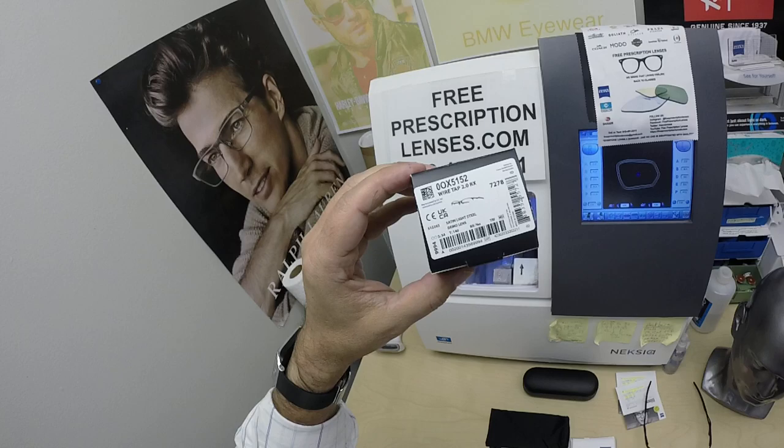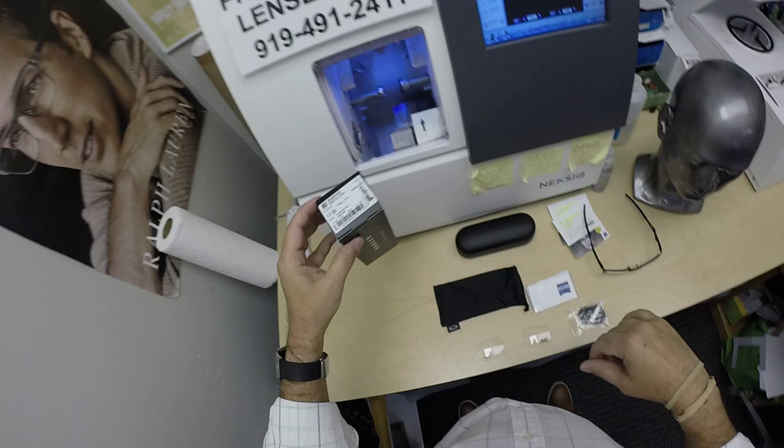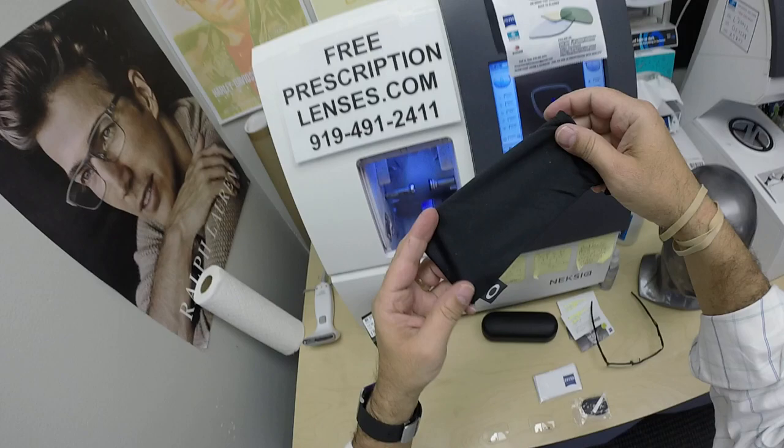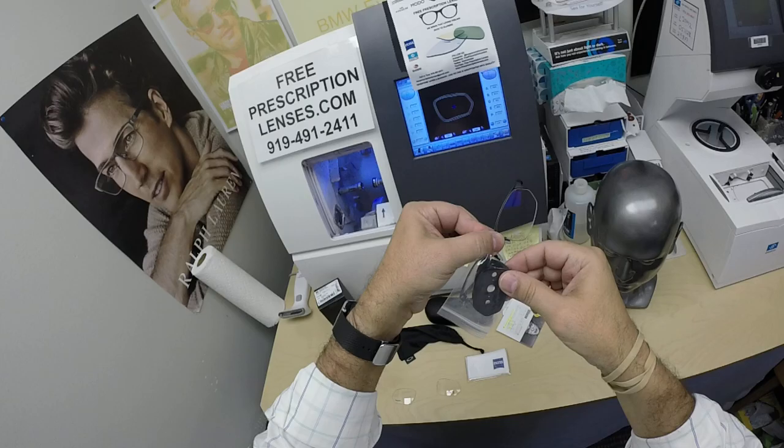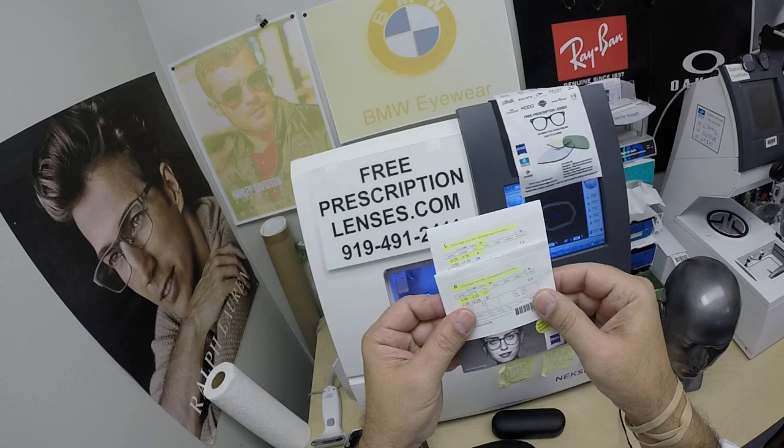You're going to get all the original accoutrements from Oakley: the gift box with the barcode showing color code 03, the satin light steel. You're going to get the Oakley hard shell case, the Oakley cleaning cloth that doubles as a carrying bag, and the original demo lenses — they even include a demo lens for the old way of tracing the shape.